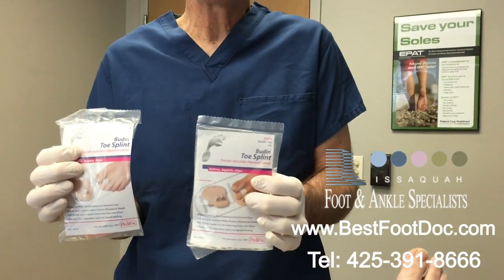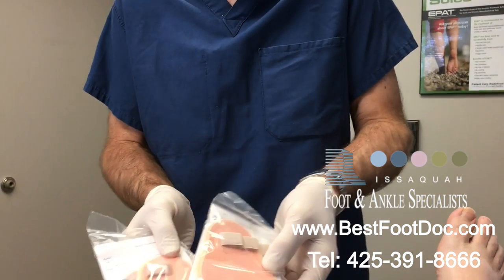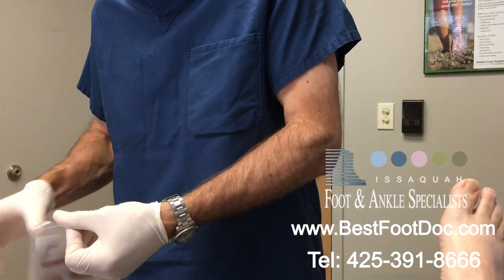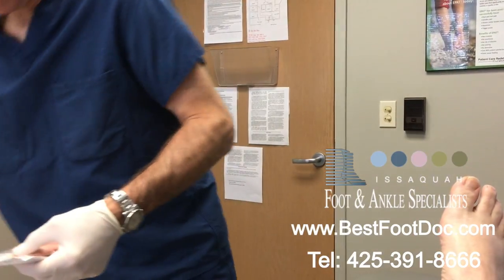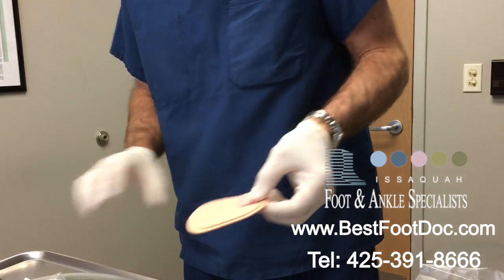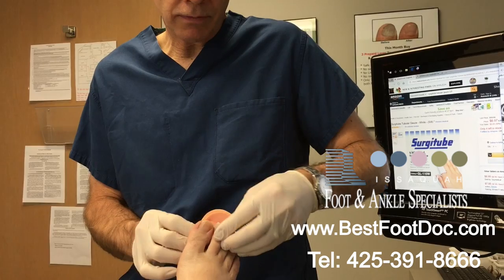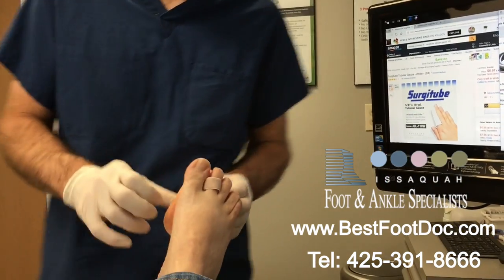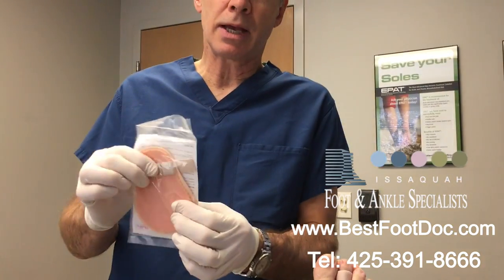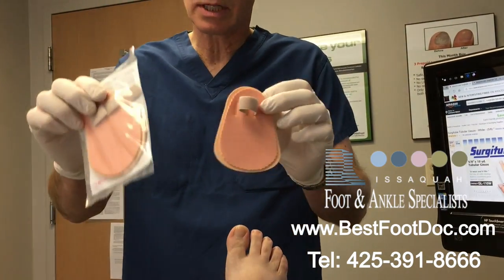These are some that you can buy — we have them at our clinic, and you can also get them on Amazon and other places. They are these little devices that strap over the toes. This is one way to do this — they go over the toes and hold your toe down. So if you've got a hammer toe, you can see how that would pull the toe down, but you've got this big lump you're stepping on. Not everybody likes that, and sometimes it doesn't really pull down at the right spot. But that's one device you can buy.